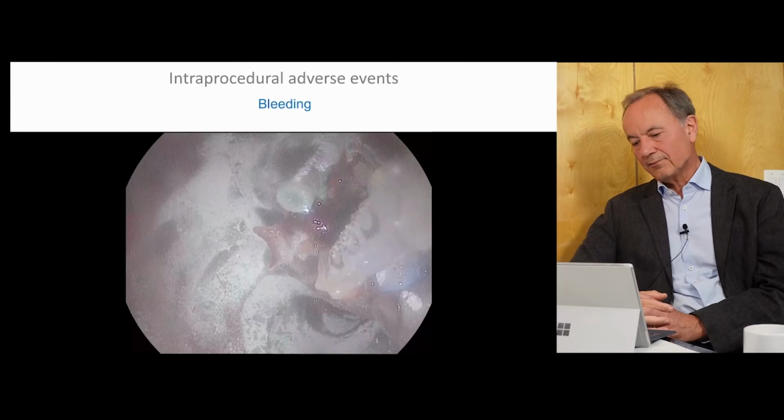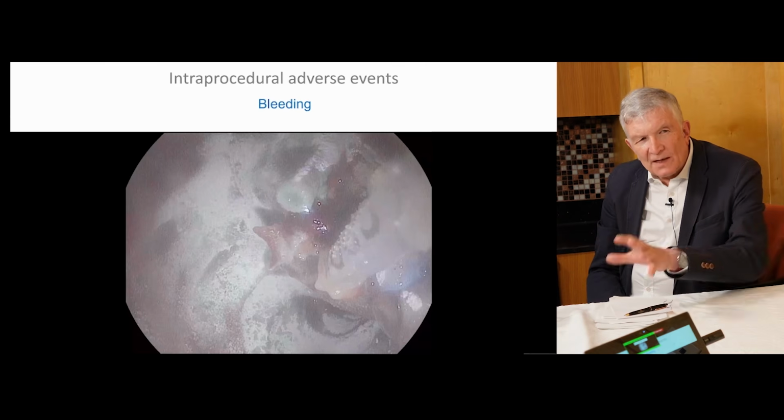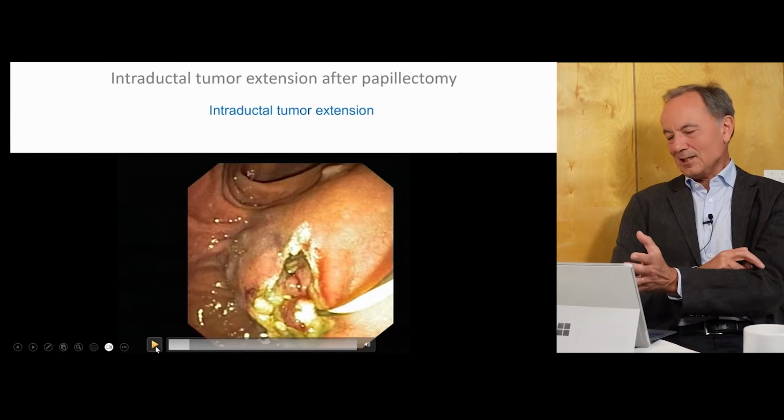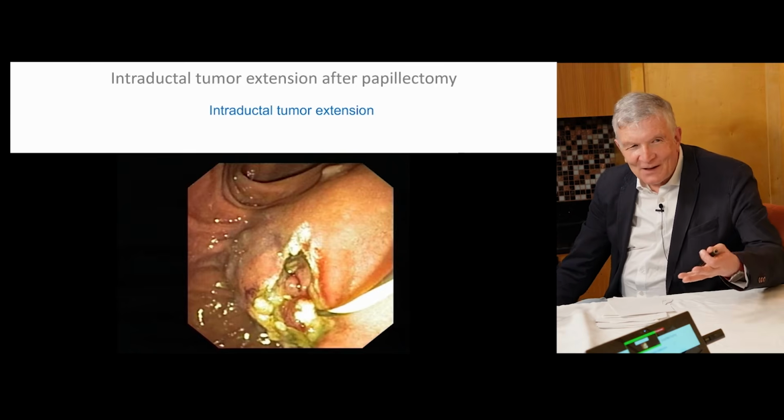And of course we have hemostatic sprays. So you're right, targeting is more difficult, placement is more difficult, it's more risky. It's a very nice combination. I don't show you only the nice cases, but also the ugly cases. That's why we are here.